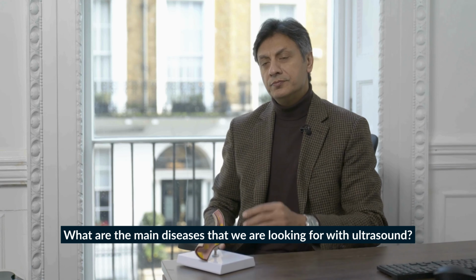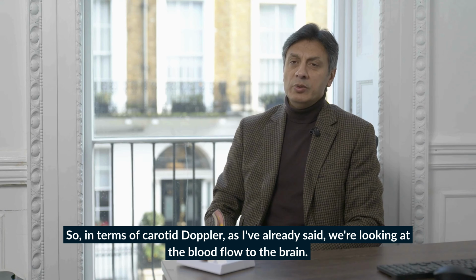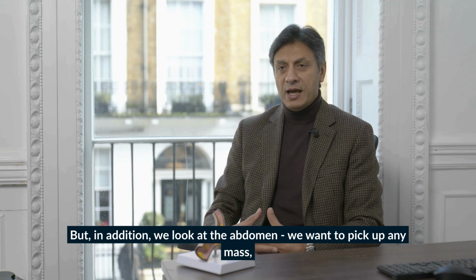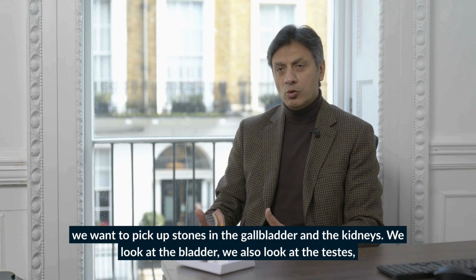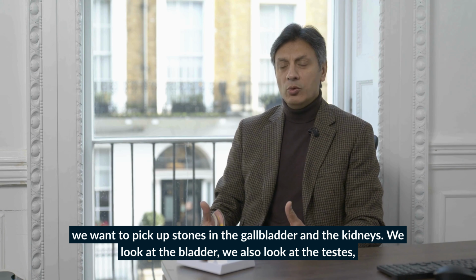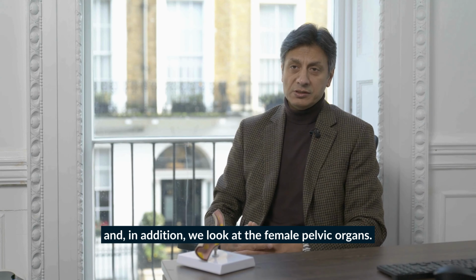What are the main diseases that we're looking for with ultrasound? So in terms of carotid Doppler, as I've already said, we are looking for the blood flow to the brain. But in addition, we look at the abdomen. We want to pick up any mass. We want to pick up stones in the gallbladder, in the kidneys. We look at the bladder. We also look at the testes. And in addition, we do female pelvic organs.